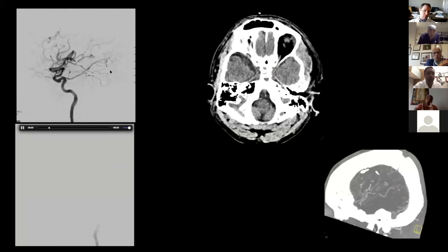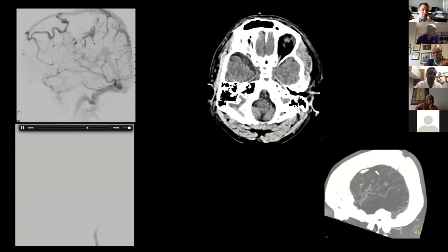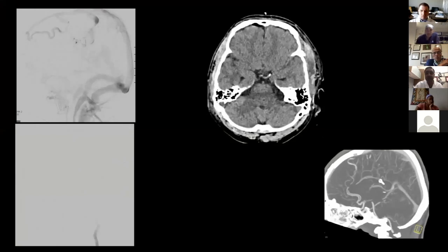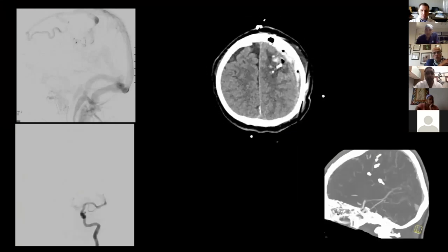And you can see here on the angio, you see the squiggles in the very, very late phase. See, there they are right there. And you might think, oh, Jesus, that AVM. It might not be fistula. This could just be the dilated venous. And so for this guy, we kept him down, kept the pressures down, and it thrombosed, as one would expect. So then a delayed 7-day angiogram, you can see that all those squiggles are gone.